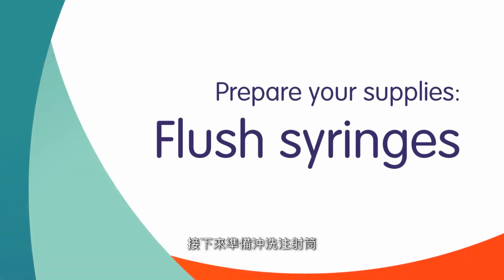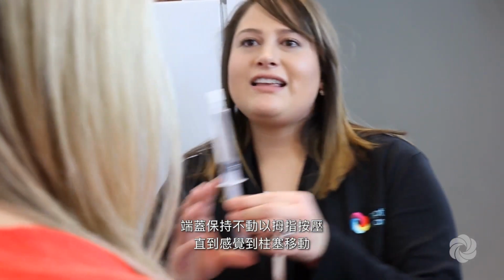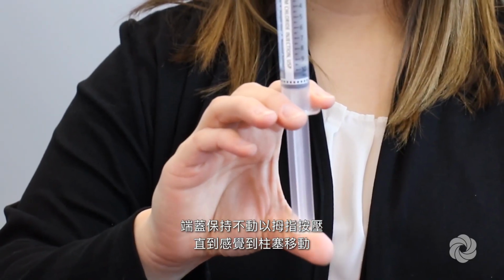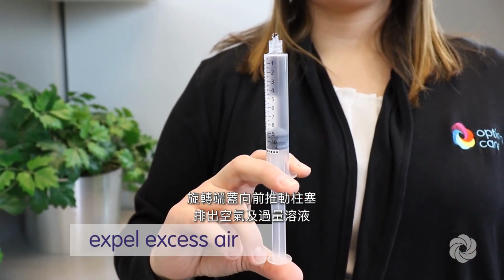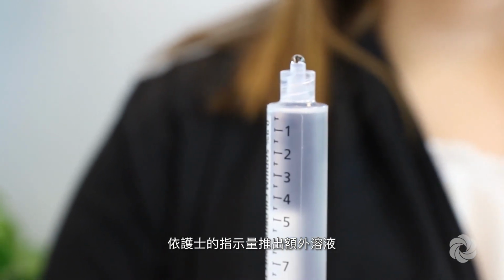Next, prepare your flush syringes. Prior to using syringes, push firmly on the thumb press with the tip cap still on, just until you feel the plunger move. Expel air and excess solution by twisting off the tip cap and pushing the plunger forward. Push out extra solution to the amount instructed by your nurse.